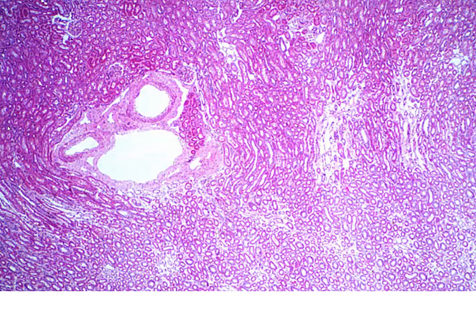Now, this image is going to be in that juxtamedullary boundary region. We know that because we've got a renal corpuscle here. We can see some more renal corpuscles, and then we get into sections through mostly our collecting ducts and tubules and loops of Henle. But what we're looking at in this juxtamedullary boundary is essentially going to be sections through part of our vasculature.